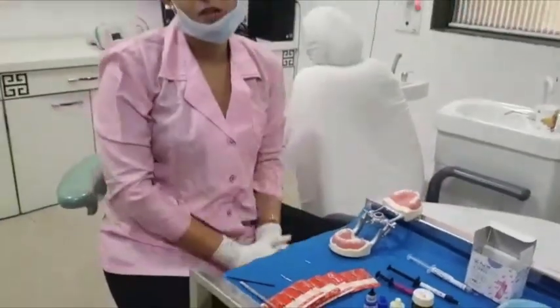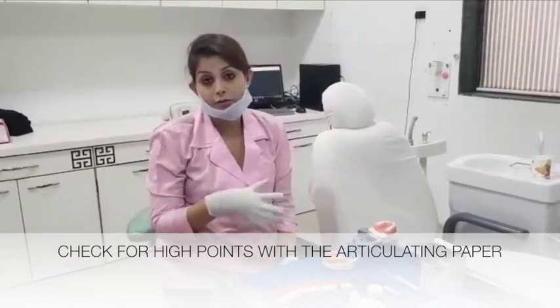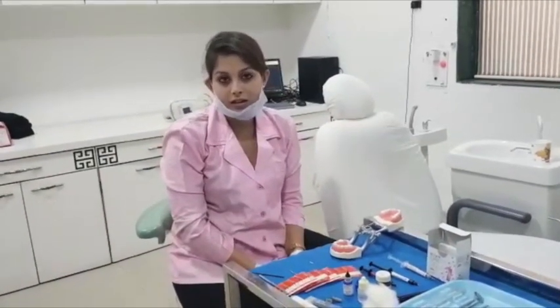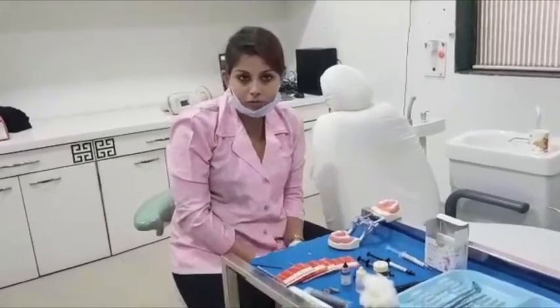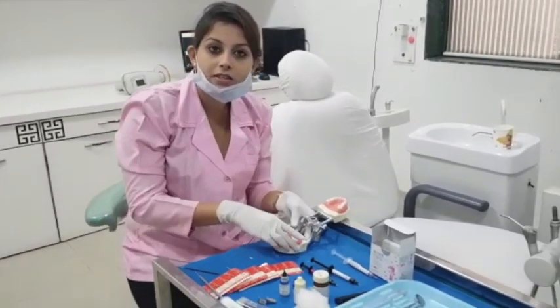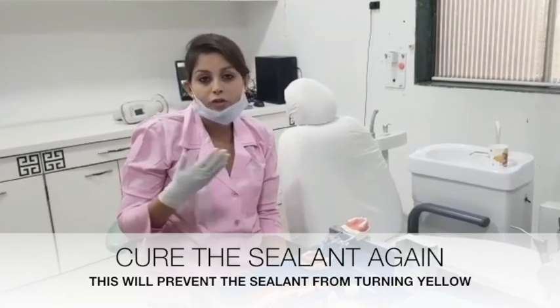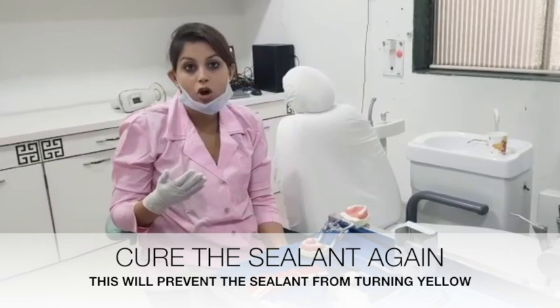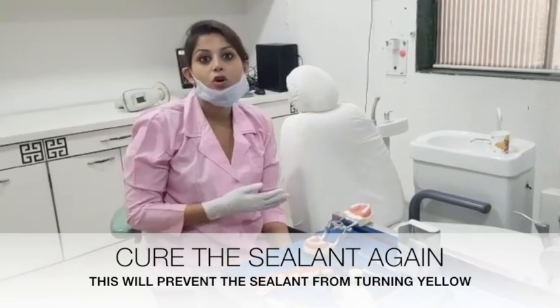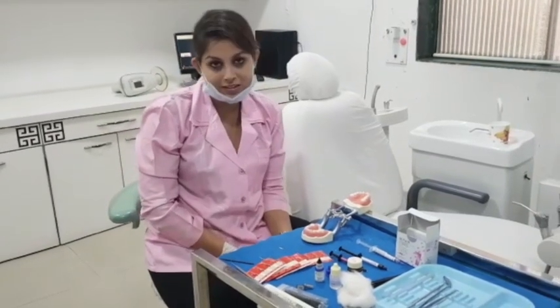After this, you do at times take articulating paper and check if you have flowed resin onto areas where it will interfere with the occlusion, and reduce it with a silicone point. After you have finished polishing your sealant, you will cure it once again to address the oxygen inhibition layer. That will really prevent your sealants or composites from turning yellow over a period of time. That was the procedure for pit and fissure sealants. Thank you.